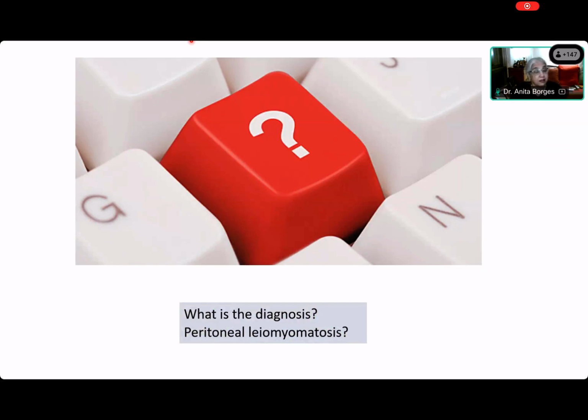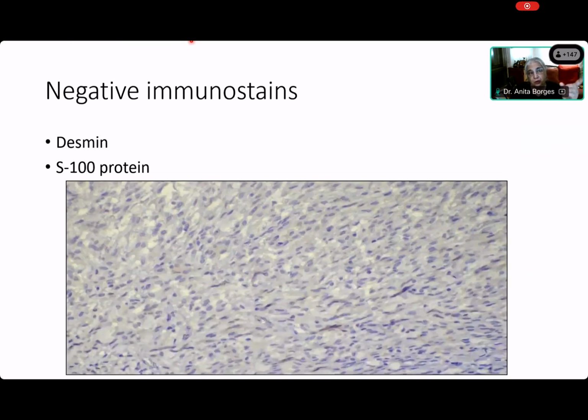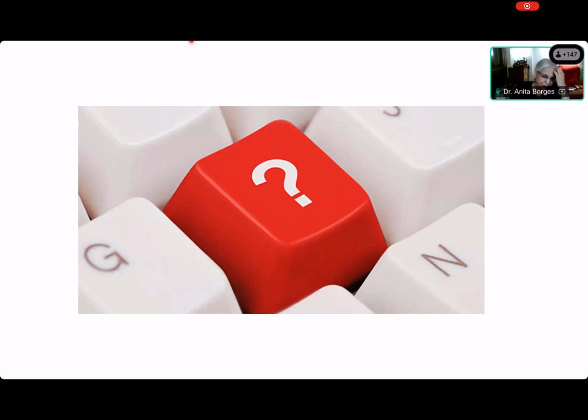But you remember that we had made a mistake. Okay, what was the mistake? We did the SMA, we did a desmin, we did the S100 protein. It was negative. Okay, but the last time we had not done a CD34. So is it enough to do SMA, desmin, and S100 protein? And the answer is no.